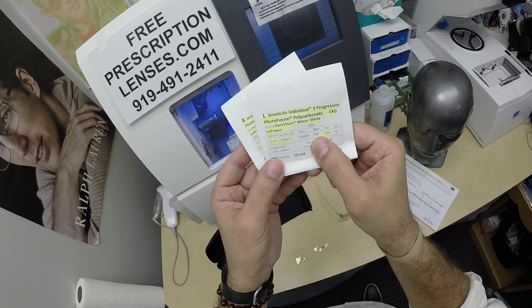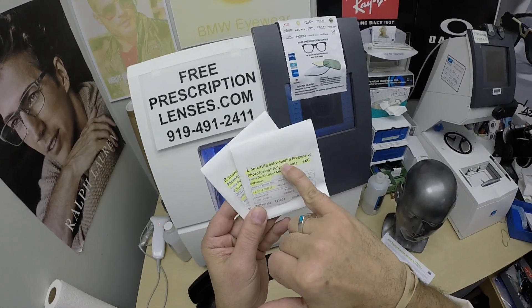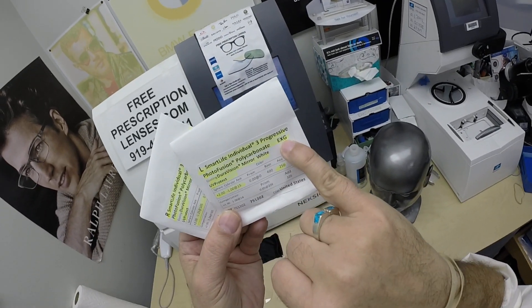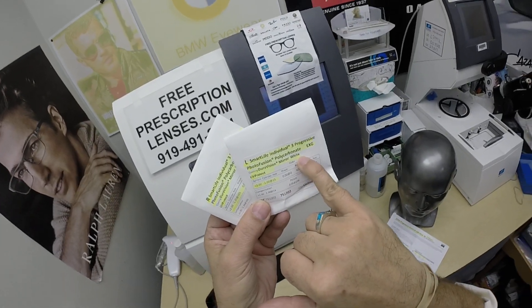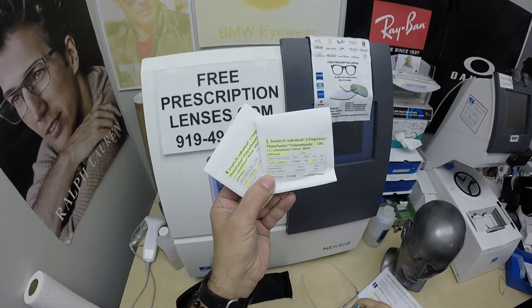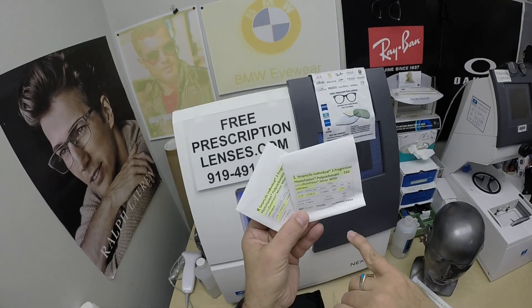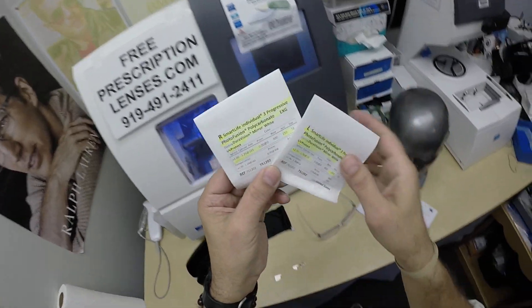You're also going to receive all the documentation from Zeiss, which has the Smart Life Individual 3 progressive lenses, the Photofusion EXG — Extra Gray in Polycarbonate — and the Duravision Mirror White, as Zeiss calls it. I call it the silver flash mirror. It's got 100% UVA and UVB protection. I've highlighted the prescription for the left eye and the same for the right.